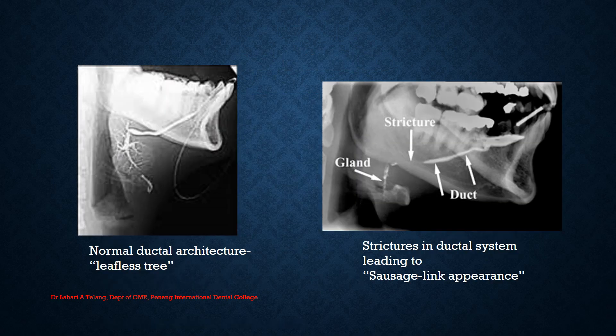After the dye is injected, radiographs are taken. This is how a normal submandibular salivary ductal system appears — the normal ductal architecture is described in radiology terminology as a 'leafless tree pattern.' If strictures are present in the ductal system, the appearance is called a 'sausage link appearance,' because the dye has not flowed consistently throughout due to the strictures.